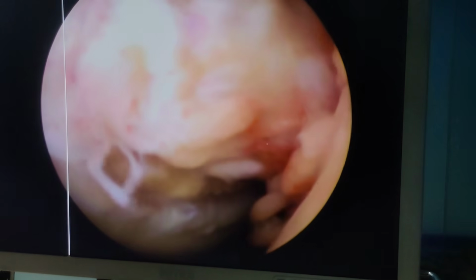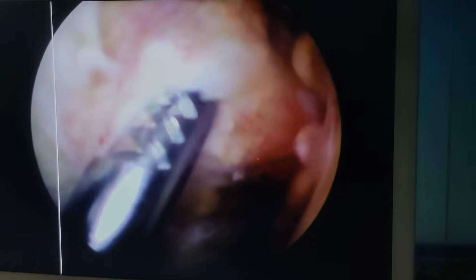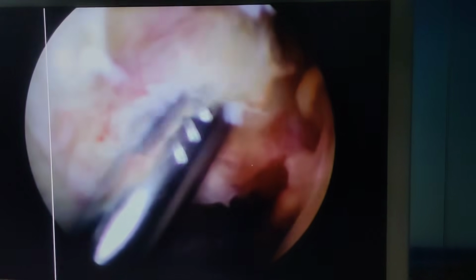So I'm just going to come in from the anteromedial portal, and then I'm just going to use a shaver just to debride it. Once I have done just gentle debridement, then I know the area where I'm going to put my anterolateral bundle, because when you're doing a single bundle, you are reconstructing the anterolateral bundle. So let me just do some debridement. I don't think that video will add anything if I just show you how I debride it. It's just a simple thing. Once I have debrided that, I will come back and I will join you.